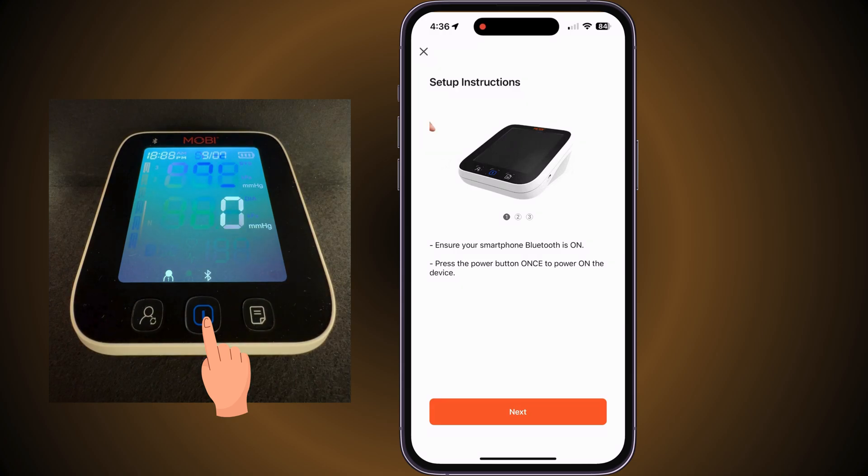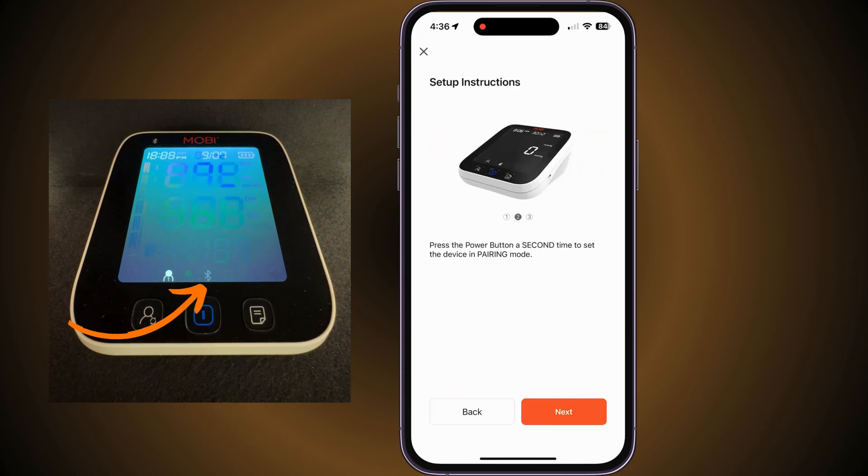In the setup instructions, ensure your smartphone's Bluetooth is enabled. Then press the Power button to power on the device. Press the Power button a second time to set the device in pairing mode.